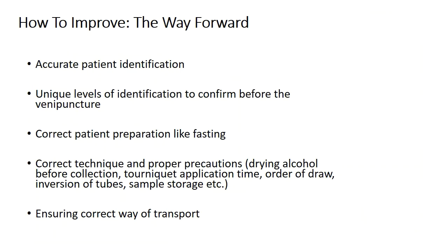Accurate patient identification. Repeatedly I am telling, proper identification is a must. Always before collection of a sample from a patient, you ask the patient what his name, age, etc. is, and you check with the bill and the test requisition form. Show the patient the name mentioned on the requisition form, that it belongs to that particular patient. It also raises the confidence of the patient that his name is mentioned on the form.